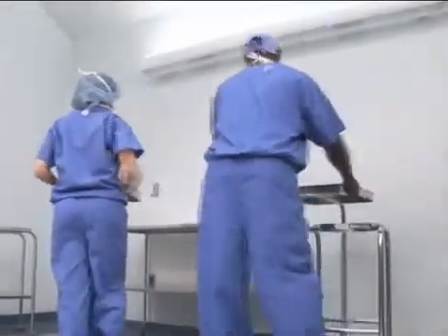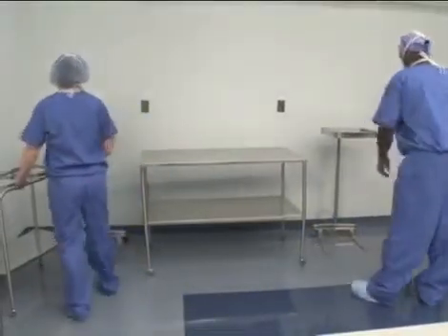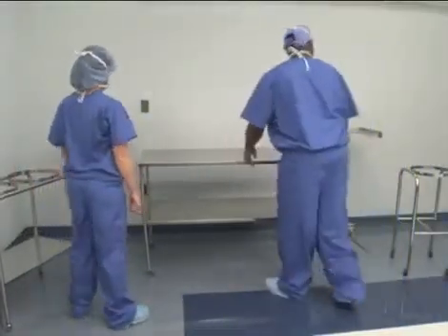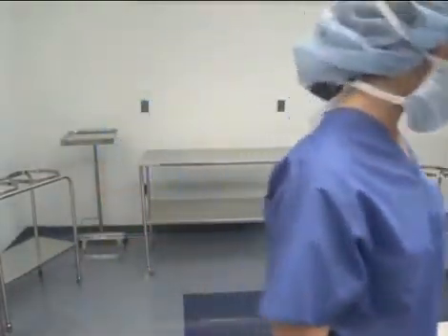The scrub and circulator arrange the operating room furniture in a logical manner to build the sterile field. Non-sterile equipment, such as the operating microscope or digital imaging cart, are brought in at this time. Arrange the furniture in the operating room to accommodate the particular procedure being performed. Keep in mind, the room is arranged to prevent contamination of sterile surfaces by traffic and non-sterile equipment.